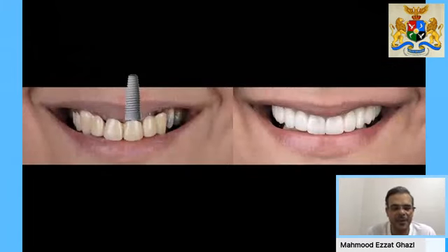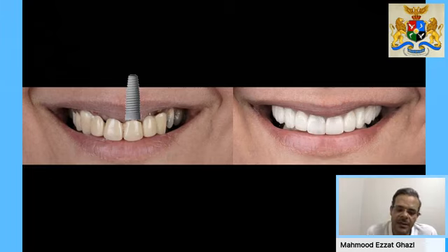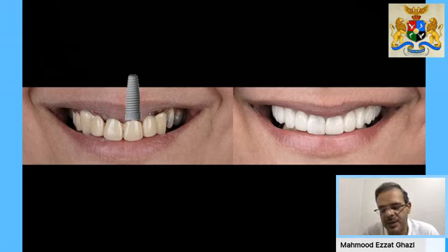If you have a look at this case, at the before picture, you can see that this was a failed bridge. The patient needed some of the teeth extracted and implants placed. And we also planned for placing the implants in the missing spaces. You can see that she has deficiencies in the papillas, but in this situation, you can regenerate these papillas once more. So accordingly, you would place the implant at the level of the patient's root, okay, which is usually 3 to 4 millimeters in depth from the zenith point of the proposed crown. So here it would be possible to regenerate the papilla once more. So you treat the implant as if it is going to replace the root, placing it, if you can, in exactly the same position that the root was in before it was extracted or just after extraction. So this is if you're going to use an FP1 prosthesis.